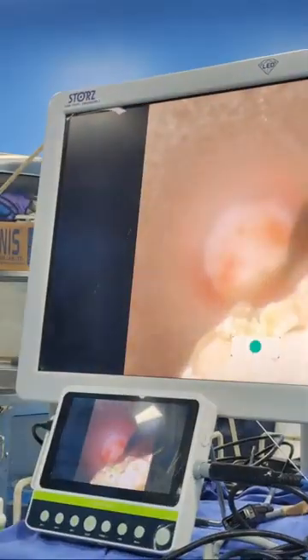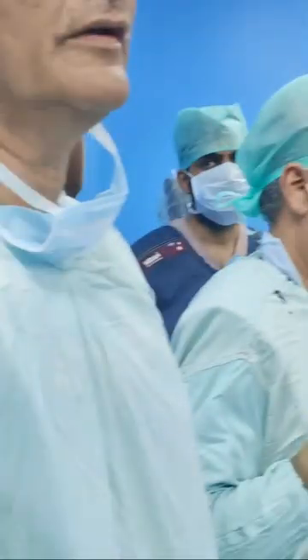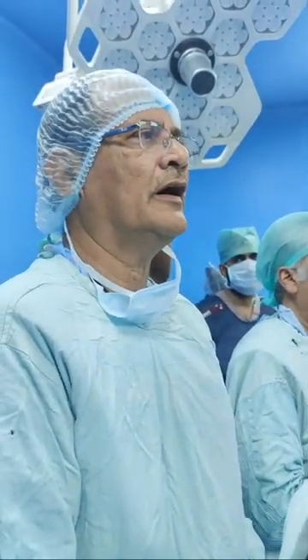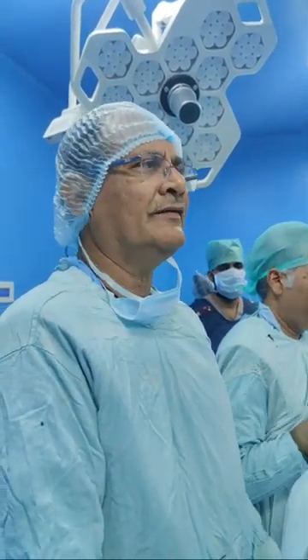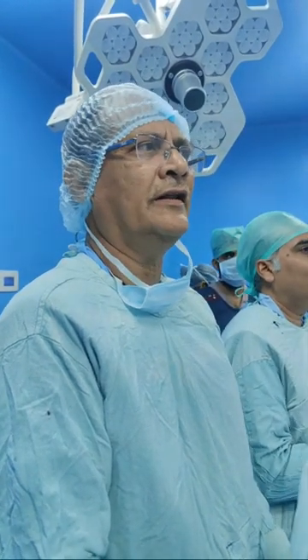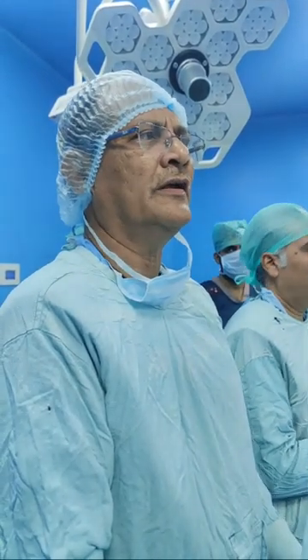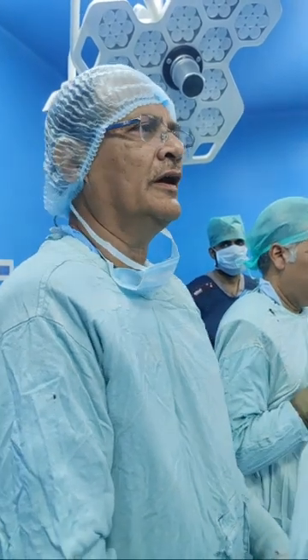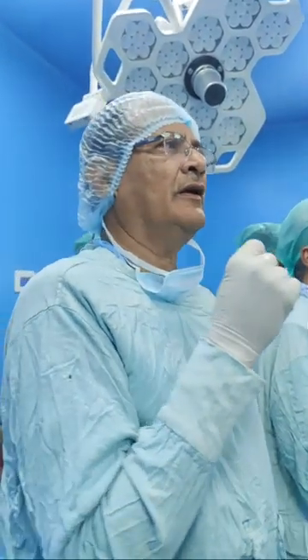With 32 watt energy, is there any chance of thermal injury to the PCS? Yeah. See, when you are using a laser energy, you have to see where you are delivering the energy, whether it is a pneumatic energy or a laser energy. The depth of the laser energy is very limited, and particularly in a pelvis, it is less injurious. But if you are working in a ureter and hitting the energy with a laser, then it might lead to a perforation there. So you have to be careful where you are hitting, and that is the reason there is a laser light. So you can come to know where the laser is going to be delivered.